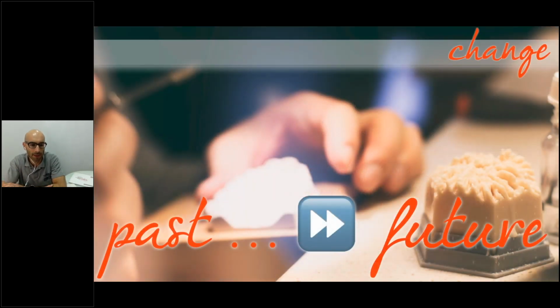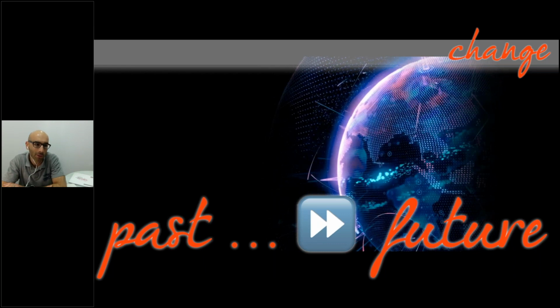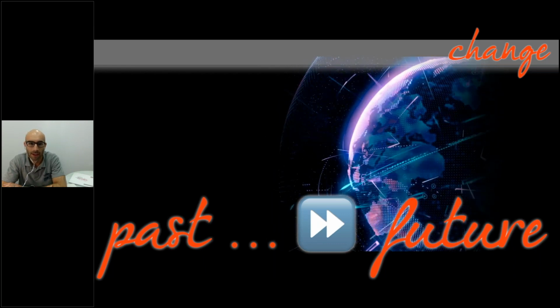So this slide represents our era, where we must be ready to think in a new way, because digital dentistry is reality. So we have to be ready for this change from the traditional wax-up with wax to this digital world.